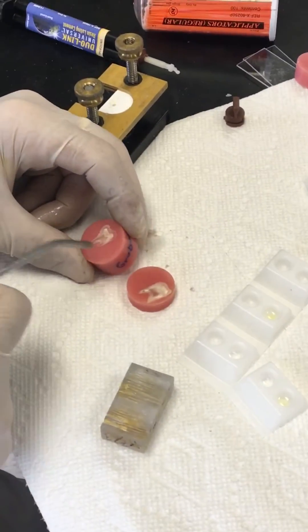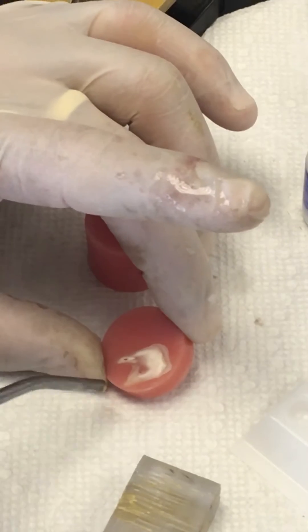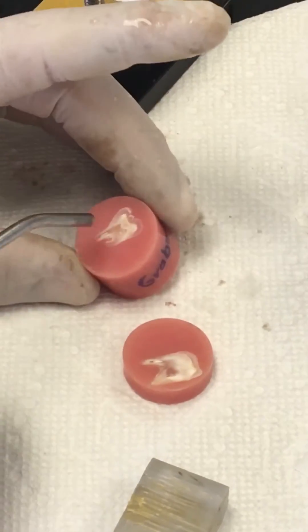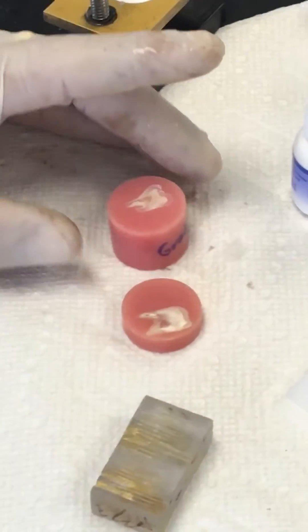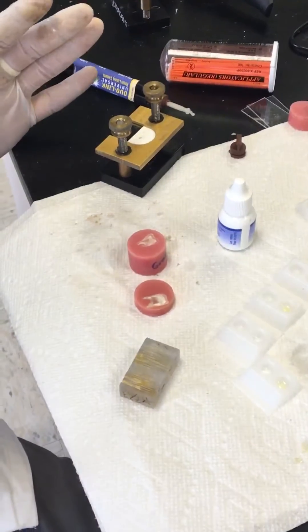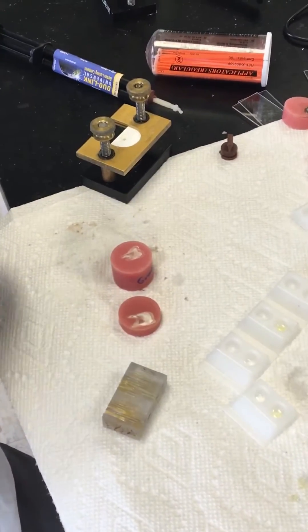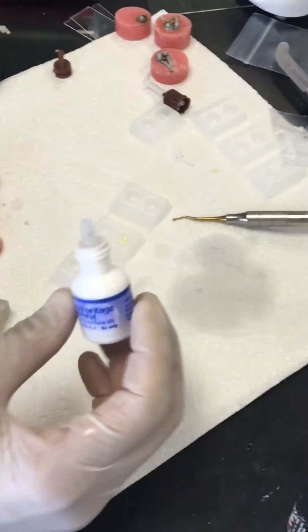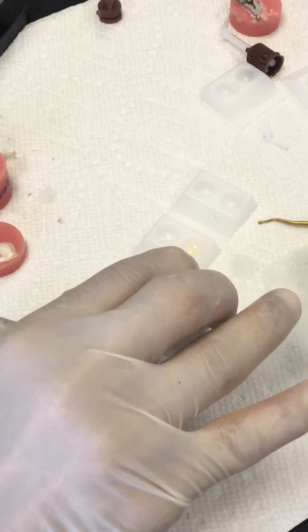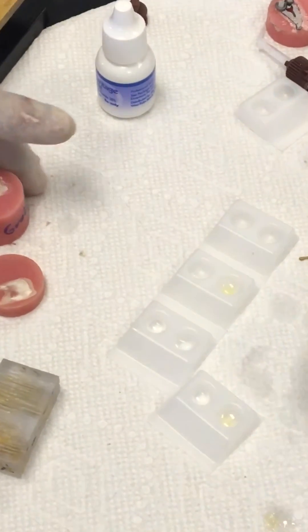The first thing is we need to dry the samples, because the instructions for Advantage Arrest require that dentin is dry. One of the things we read in the instructions is that it said it might turn teeth black — not necessarily, but it might. Those were the words. So Advantage Arrest — I'm applying it right here. This is just silver diamine, 38%.